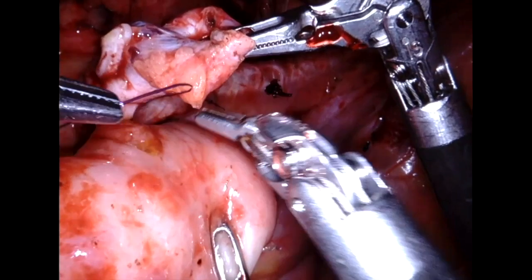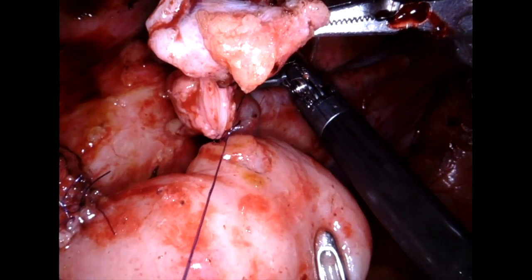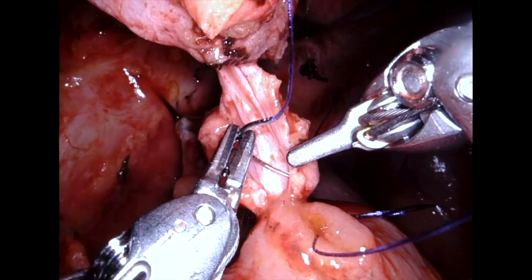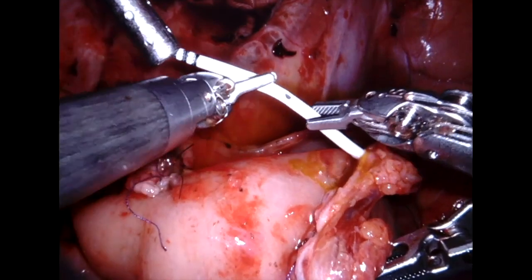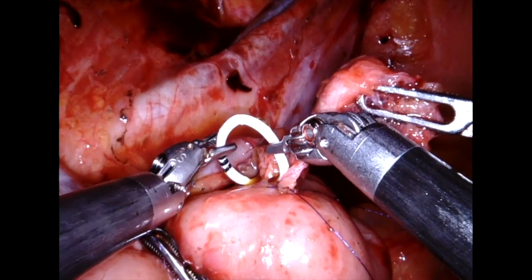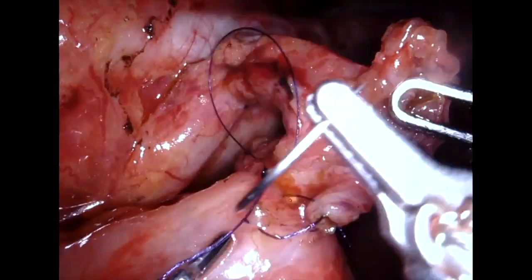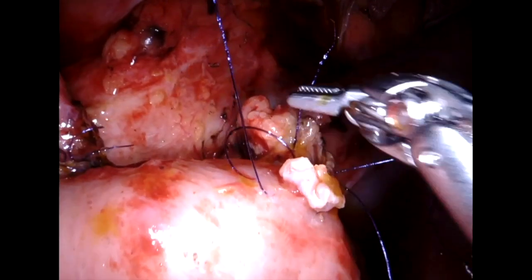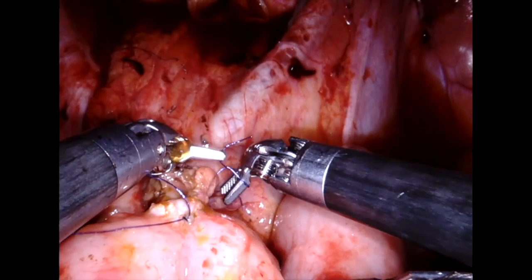Once the left anastomosis is completed, we now direct our attention to the right ureteroileal anastomosis, similarly taking sutures along the posterior wall, placing a stent across the anastomosis, and then completing the sutures of the anterior wall. Circumferential sutures are taken, and finally both the walls are closed.